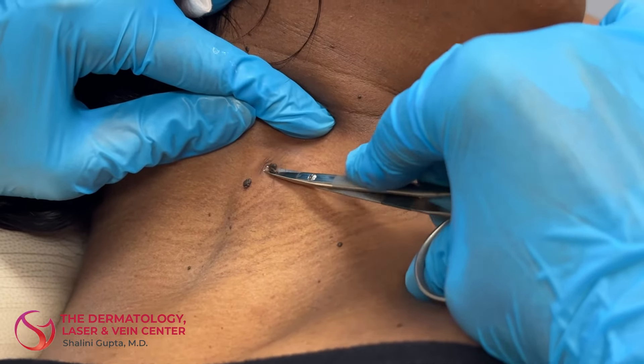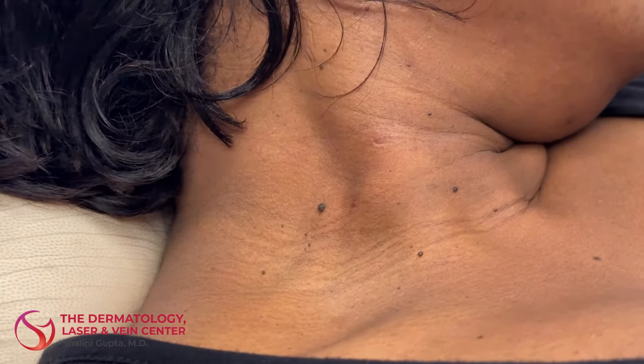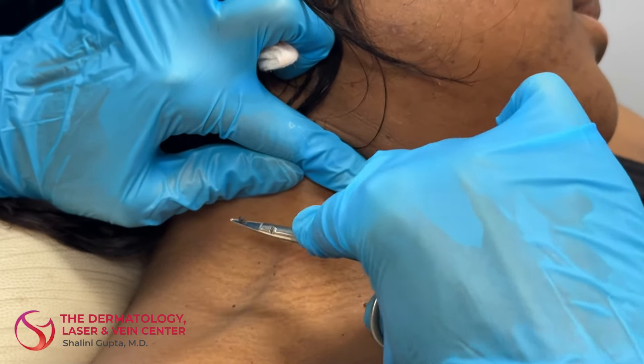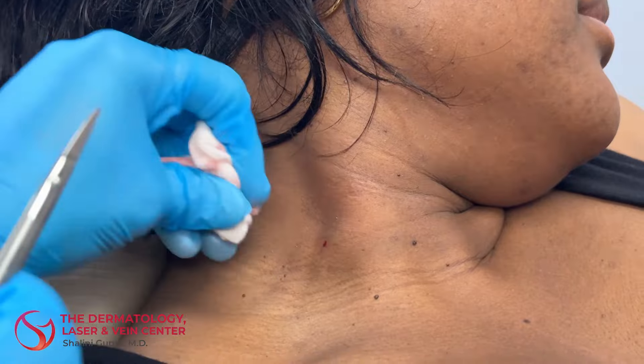So this is what we call a radial scissor, and they just come off really nicely. It doesn't leave a scar because the skin tag is on such a tiny little pedicle, and it just literally comes right off with a nice sharp scissor.